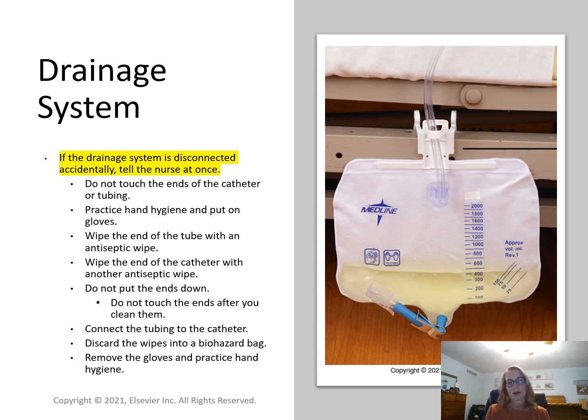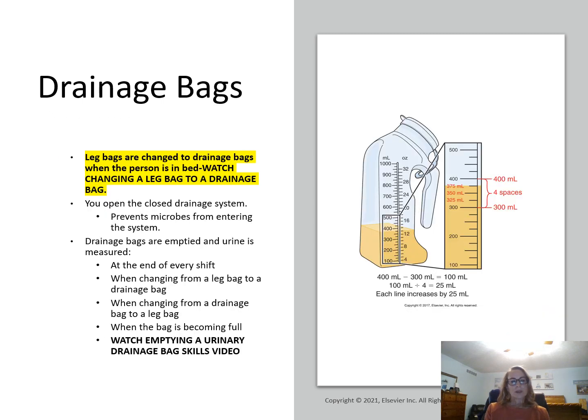So this is the area we're talking about. When we learn how to empty this bag, we would cleanse both sites. We never let any of that touch anything else, empty it, and then we recap it. Okay? Leg bags are changed to drainage bags when the person is in bed. And again, I want you to watch the skills video. You're going to open the closed drainage system so it prevents microbes from entering the system.